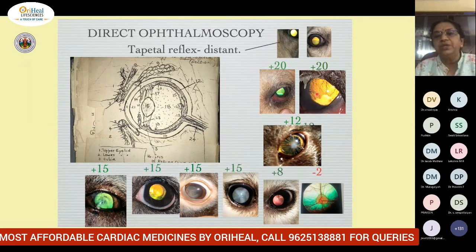You can see something new here. There is discharge as well as vascularization. So pannus is there, and this type of pannus you will be able to read well. Even in a minute one, here you have plenty of vascularization, but sometimes you will find just one thin vessel running. That also you will be able to examine with the help of a plus 20 diopter in the direct ophthalmoscope.